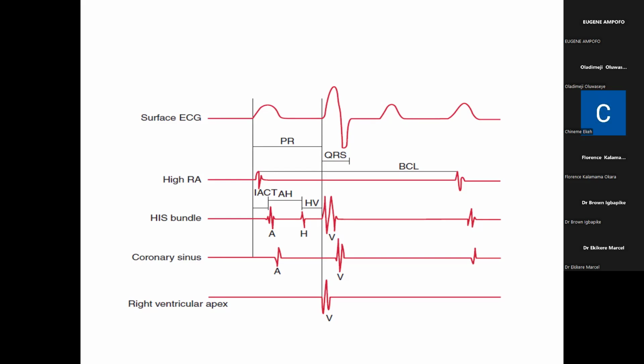No worry. But I just try to break it down as much as I can. That's why I want to be sure you understand so that as we are moving on, it still will be clearer. So if you have any questions, just ask me. Okay, fine. So remember that there's always a surface ECG to help you also interpret or follow through what is happening in the catheters.